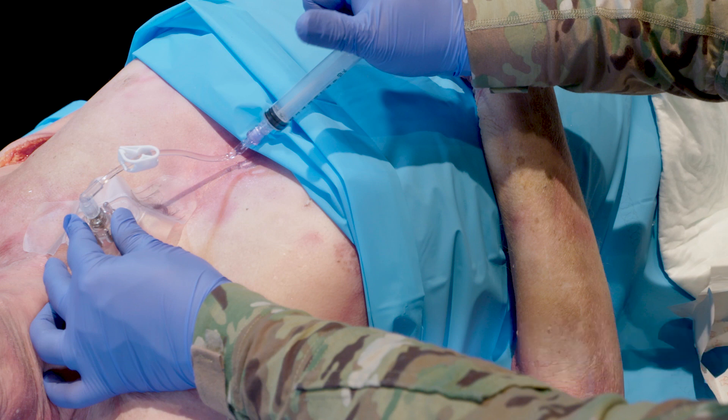Once the Tylen needle catheter has been flushed, administer fluids or medications using pressure as indicated. Frequently monitor the insertion site for extravasation and hold the Tylen needle system components firmly in place on patients during transfer.